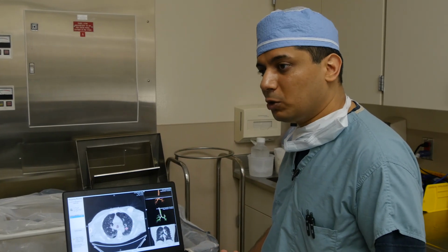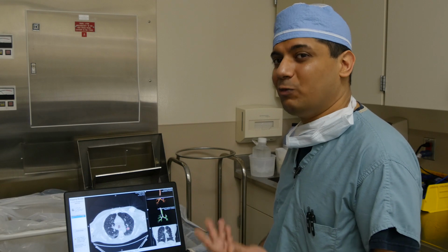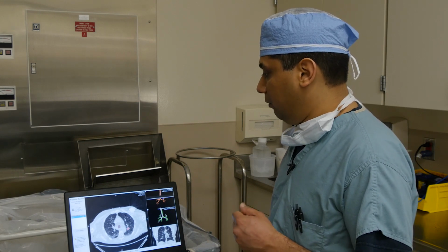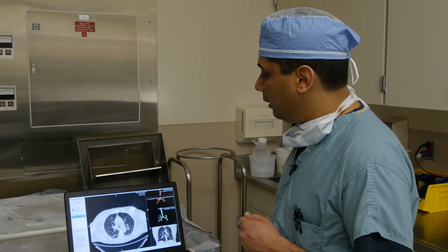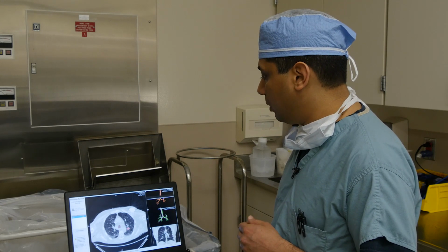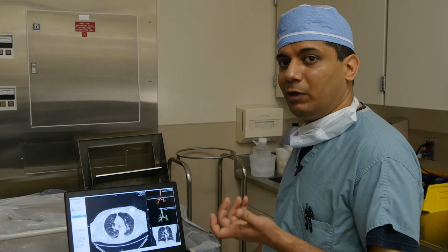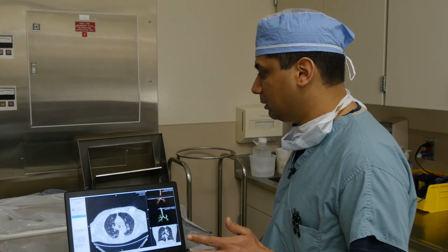If there's significant motion in the nodule, there could be a mismatch between where we are picking up the nodule and where it actually is, and then we can adjust for it. In this case, even though the motion is about 12 millimeters, it is not affecting the nodule location and the airway leading to it, so we don't need to make any more adjustments here.